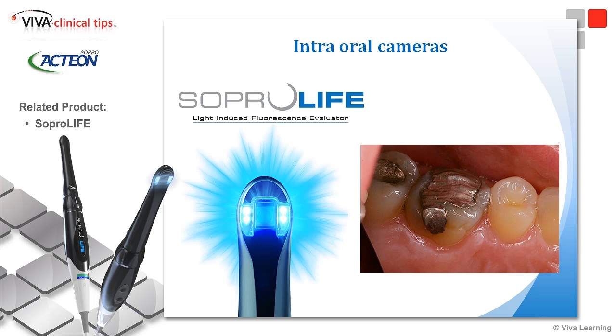I need to document something either before and after so a patient perceives the value of placing a composite instead of having that amalgam. Showing the patient in a situation like this, well, you have a large restoration, you have a gap between the tooth and the restoration. That's why we need to do something.